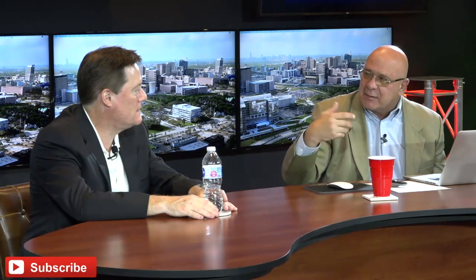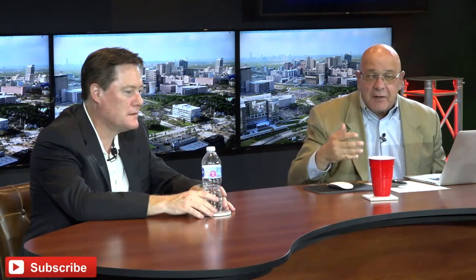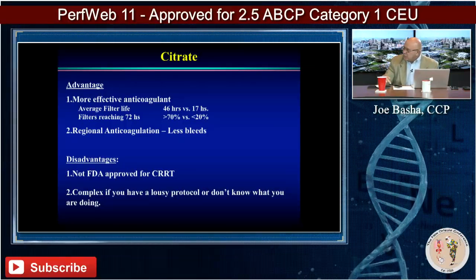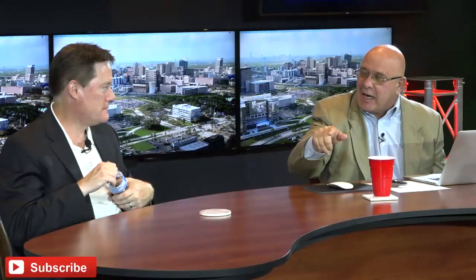But it's really good, but you can basically chelate all the calcium, and then you have a central line where you replace the calcium in the patient, and it gives you the formula there on how to do it. And it's very helpful. What you can't do is make the mistake of putting the calcium into the same dialysis catheter and having it get sucked back up, because then you clot your system off, or trying to give calcium in a peripheral vein. It's got to be in a central line, right? We all know that. Now, keep in mind, this is not an approved technique, so it's off label, but there's plenty of published protocols for this. They exist all over the place, and it's very beneficial, as I said.